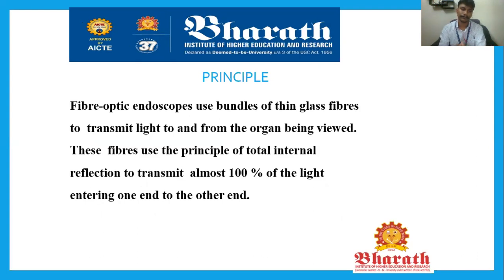Principle of endoscopy. The ultimate working principle of endoscopy is that endoscopes are widely made up of fiber optics, thin glass fiber materials that transmit light from one point to another, which captures the internal organ being viewed inside by the camera and carries it from inside to outside, to the monitor.